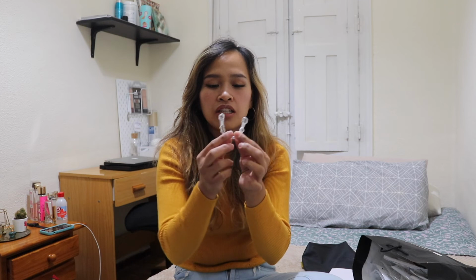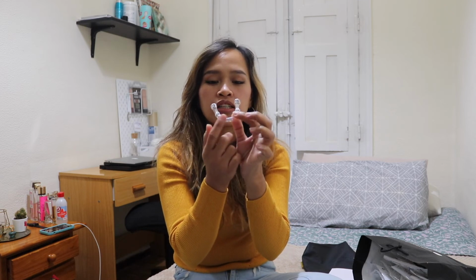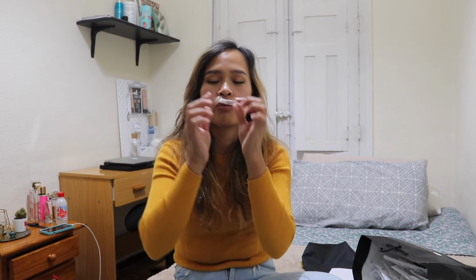So all in all, guys, I really love it. Oh wait, I'm going to show you. This here, it's still a little bit painful. Look, I have it here. When you put it in, first in the front, then you go on the way back. And because this is the last one, it's very smooth, and I got my attachment out. But normally you should hear a clicking, which means you put your liners in a perfect position.